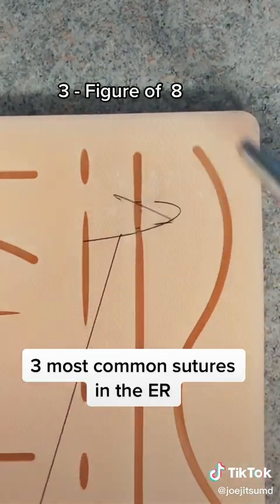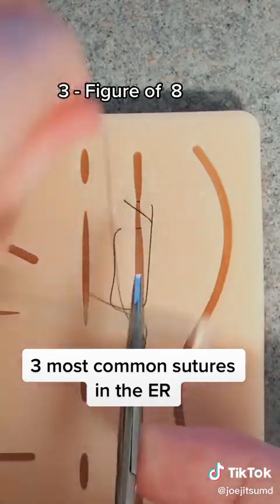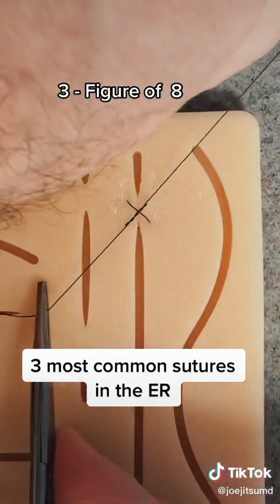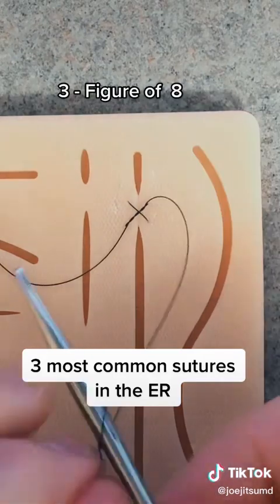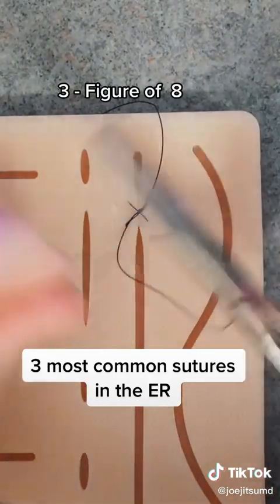Just like before, 2 wraps around the needle driver to close the loop, followed by several subsequent knots to provide additional tension strength. This is not an exhaustive list, but these are the 3 most common types that I use every day in the emergency department.